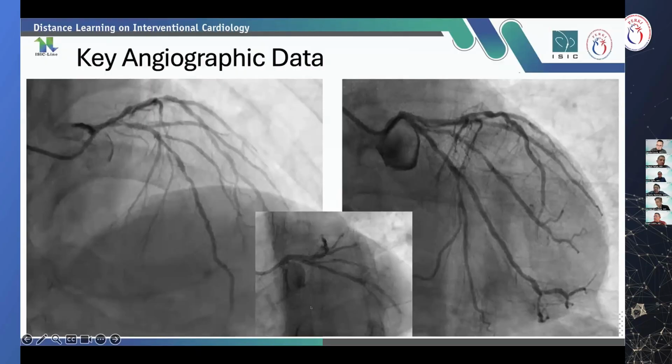You might also appreciate that, as compared to the distal run-off, the left main is quite the same. It means I saw that this left main seems supposed to be bigger than our visual imagination. And then we could obtain the score of the OCT, not only the thickness, but also the circumference and also the length of the calcification. This is my opinion.